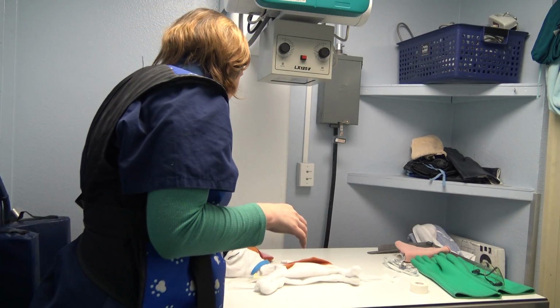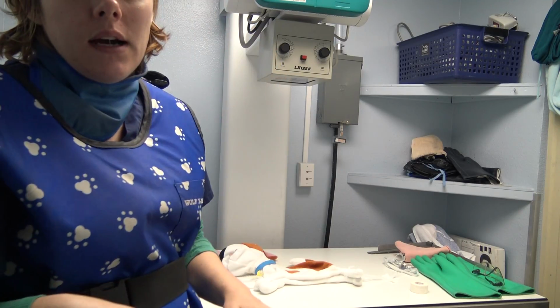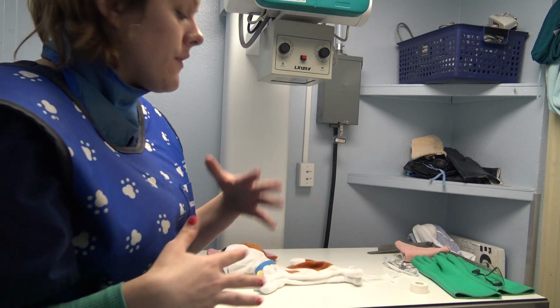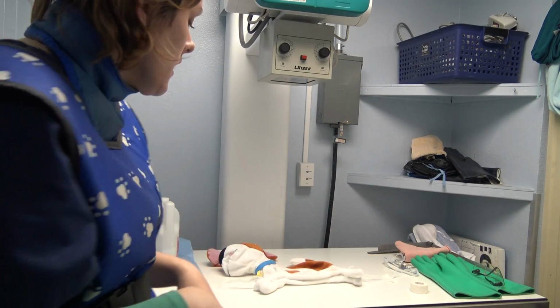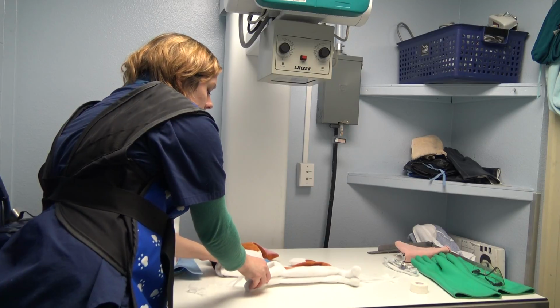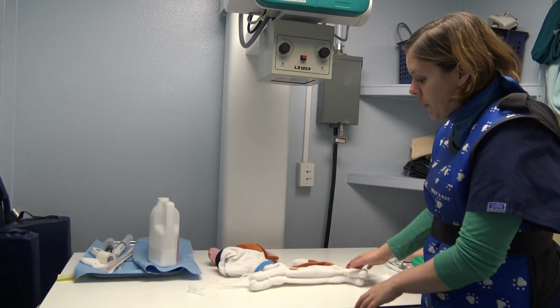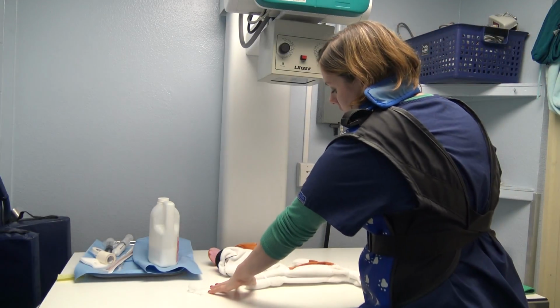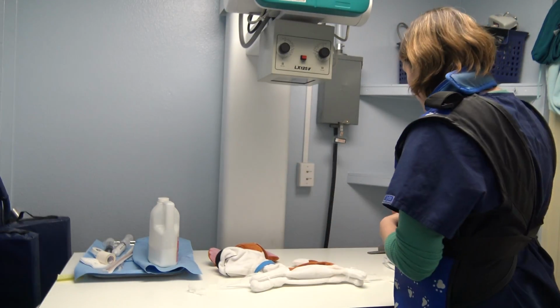So for this patient in a barium study, a lot of times you're not going to sedate because you don't want to slow down the GI tract, so they would be restrained with hands on his side. You want to make sure that you have the front limbs pulled forward and the hind limbs pulled back. While I won't have anyone demonstrating, I went ahead and taped the limbs that way, and you can put a sandbag on the neck if this patient in theory was sedated.